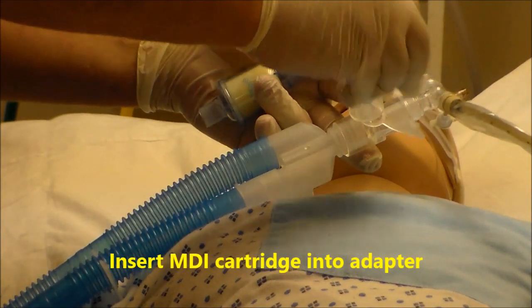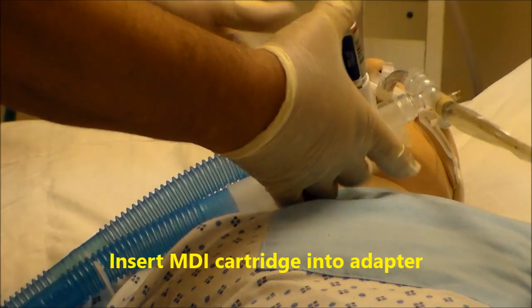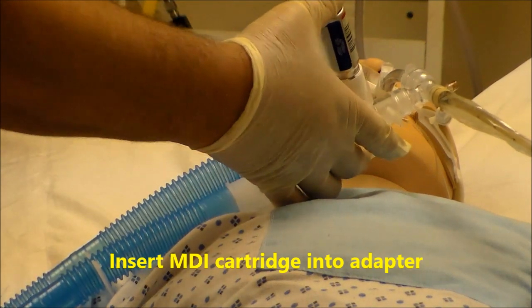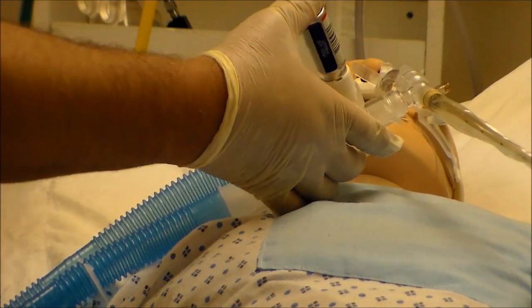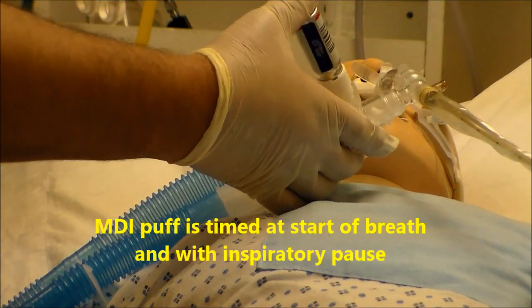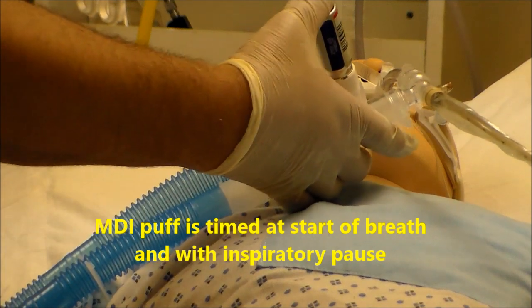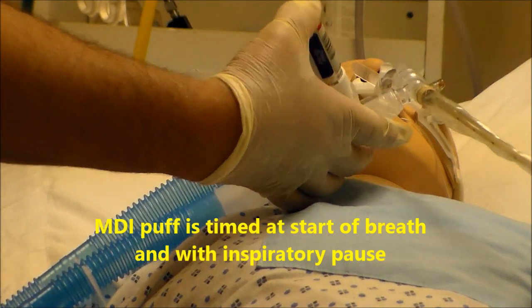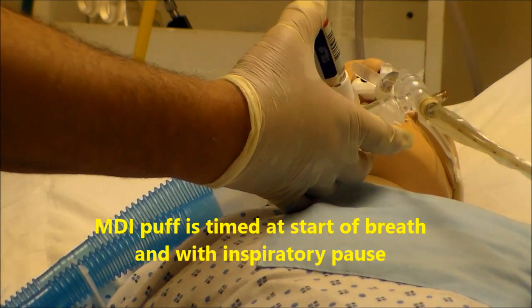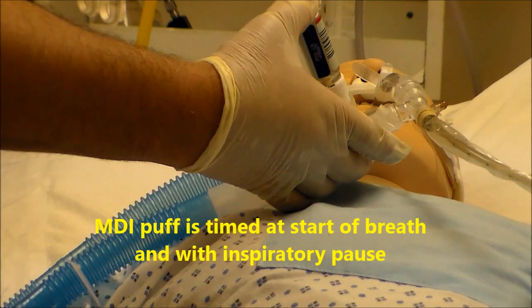Then place your MDI in the adapter and again time it with inspiration. Give them a puff on inspiration followed by an inspiratory hold to help distribute the medication into the lungs.